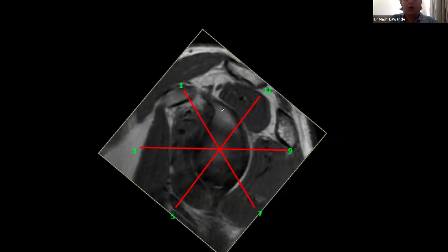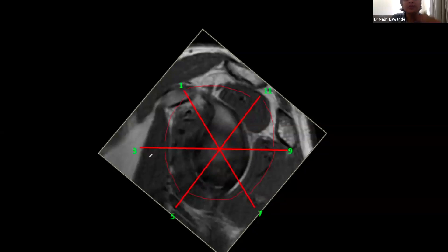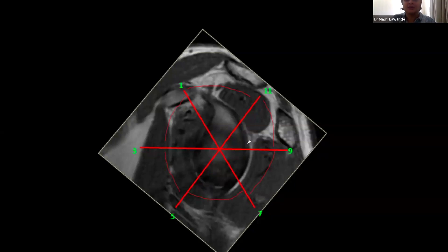The best approach is to combine quadrants and the clock together: superior, posterior superior, posterior inferior, inferior, anterior inferior, and anterior superior labrum. For example, you might describe a tear involving the entire anterior labrum extending across 12 o'clock into the posterior labrum up to the posterior equator, giving the surgeon the full extent of the tear.